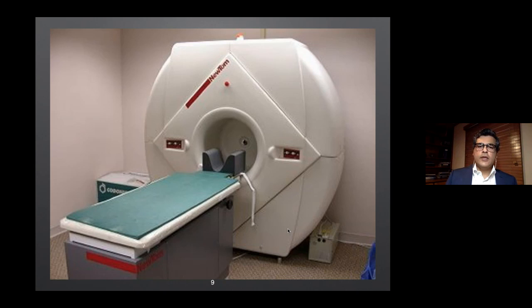Interestingly, the CBCT technology, before these four researchers optimized it for dental and maxillofacial imaging, the work had been going on for at least a decade. The intent was to use it in cardiac imaging and not in dental and maxillofacial imaging, but it wasn't very successful at the time in imaging the beating heart. And then in 1991 it was adapted for dental and maxillofacial applications.